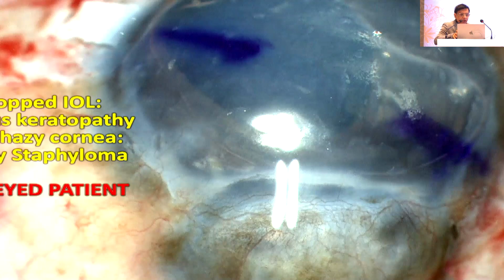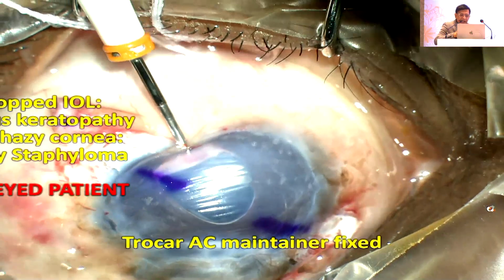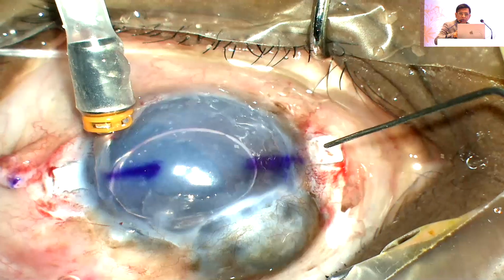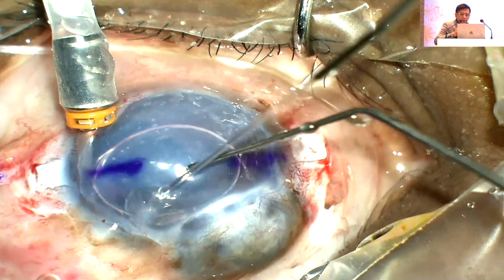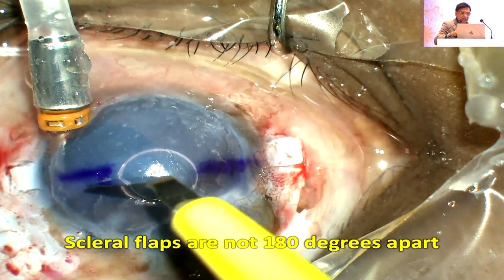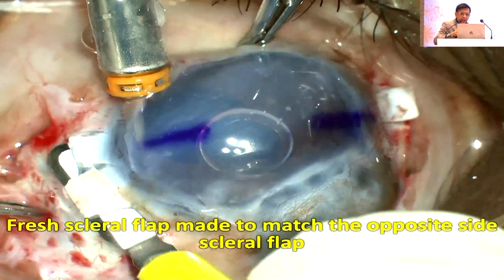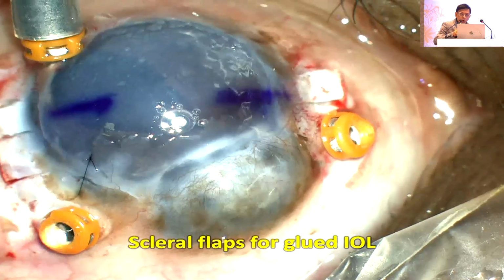This was the patient. Look at this, dropped IOL, bullous keratopathy with hazy cornea, and there is a huge ciliary staphyloma, okay? The problem here is, what do I do? I can't do anything on the top. If I cut there, I'm gone. So I make my flaps, and they were not 180 degrees, so I make it better to make the flaps 180 degrees. Now this patient had a one-piece, non-foldable IOL inside. Remember, this is the only eye of the patient.